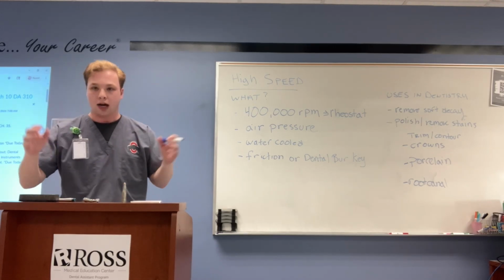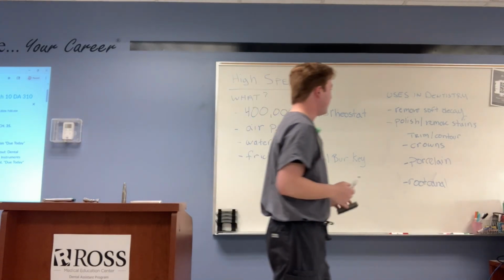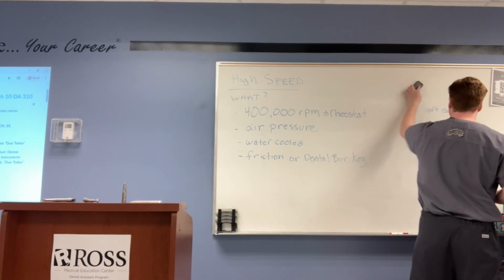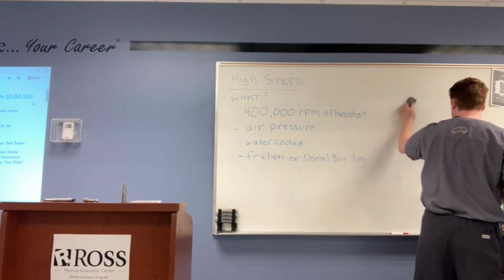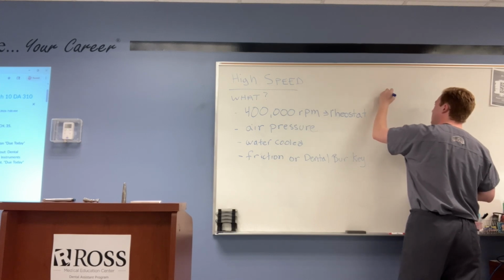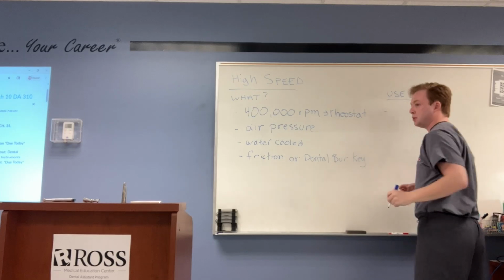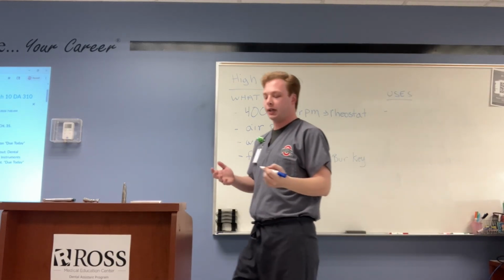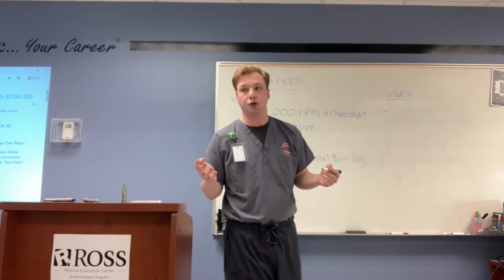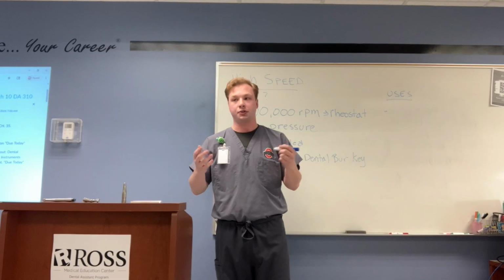Okay, now let's talk about the uses in dentistry. The uses are pretty similar, but you can get a little more specialized with this one. So the first use is you can also remove decay, right? You can remove decay, you can remove tooth structure, you can remove a faulty restoration.